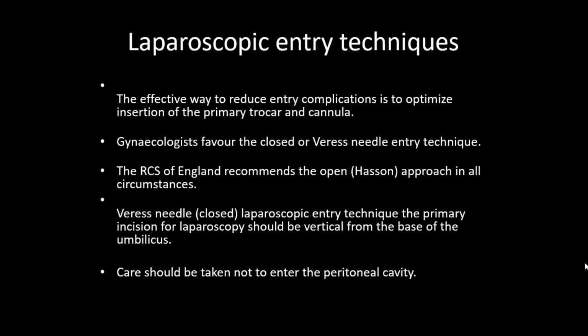Okay. There is a high risk group of patients for whom the college does not recommend the Veress needle entry technique or closed entry technique, because they are more liable for complications. This group includes extreme body mass index, either very low or obese women.